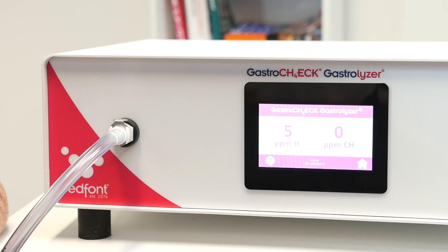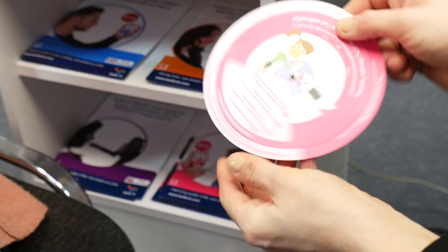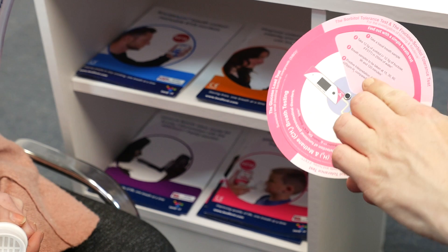Press the home button to return to the home screen where you can repeat a breath test if necessary. Readings and results can be interpreted using the interpretation wheel included with the Gastro Check.